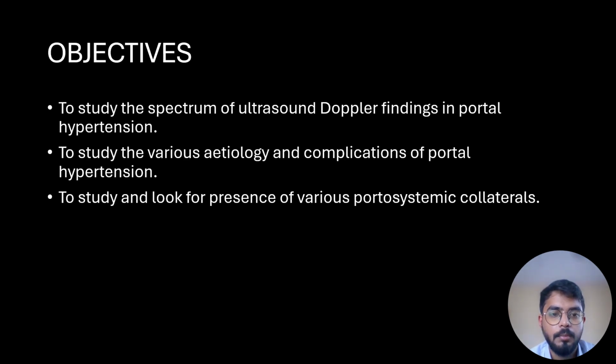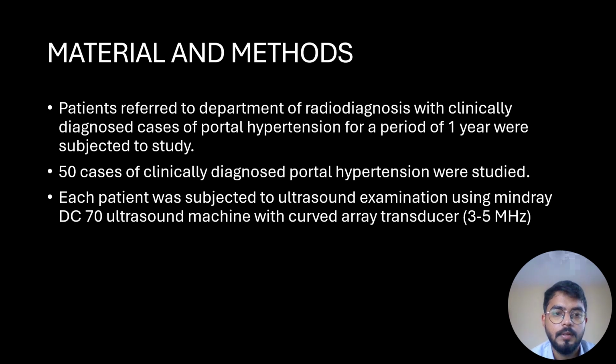Objectives: to study the spectrum of ultrasound Doppler findings in portal hypertension, to study the various etiology and complications of portal hypertension, to study and look for presence of various portosystemic collaterals.